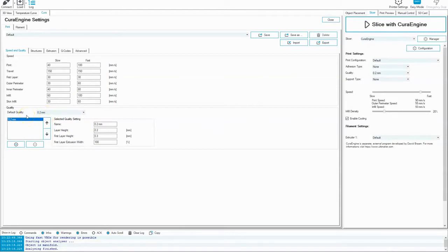I have printed this mask at 0.2 millimeters. In the printing information, it says you can print it at 0.15 millimeters. I've had success at 0.2 and had a nice, sturdy, strong mask. So I'm going to keep that at 0.2. If you'd like to try 0.15, that would be fine also.